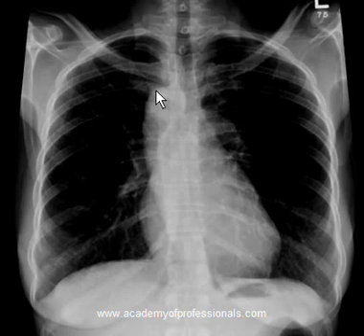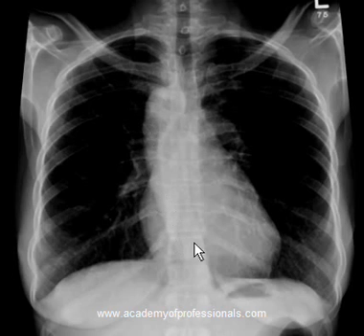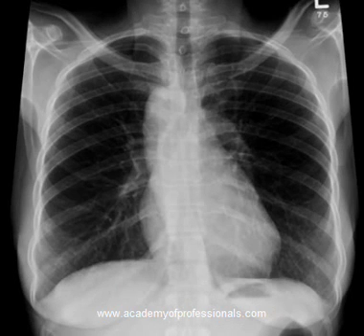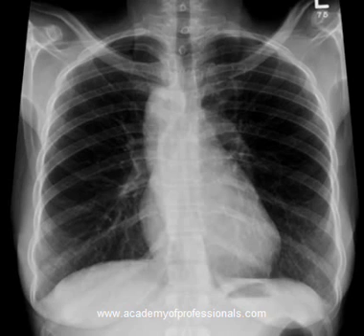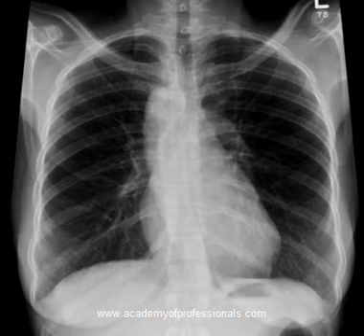This is a right-sided aortic arch, and the descending aorta is also on the right-hand side. A small percentage of people have a right-sided aorta, and it can be asymptomatic or associated with complications. Right-sided aortic arch with mirror image branching is frequently associated with cyanotic heart disease, a congenital defect which results in low oxygen levels in the blood.